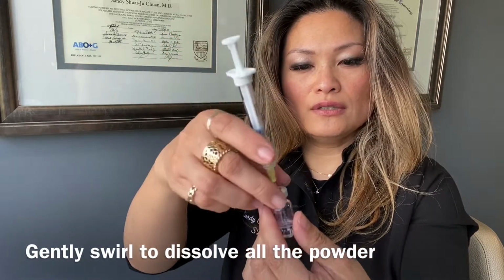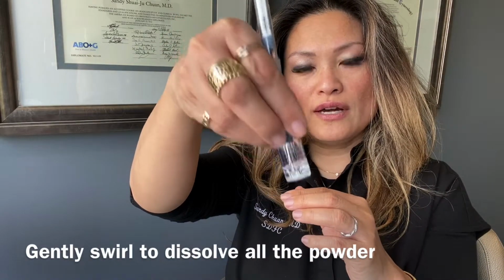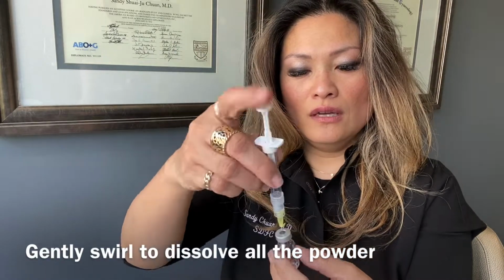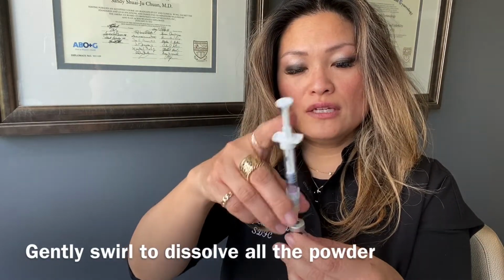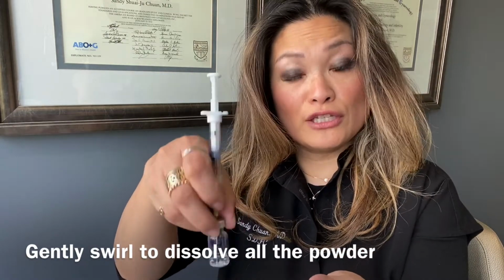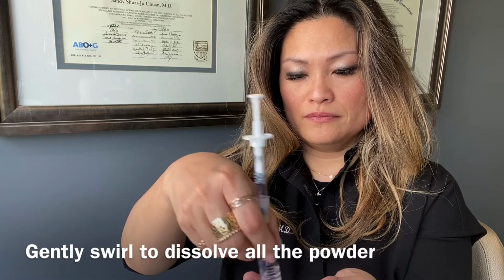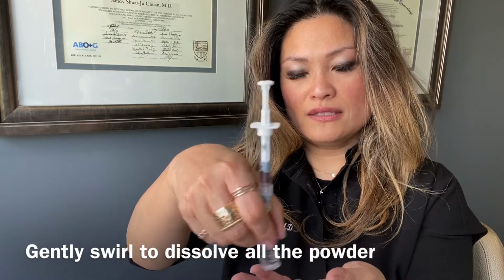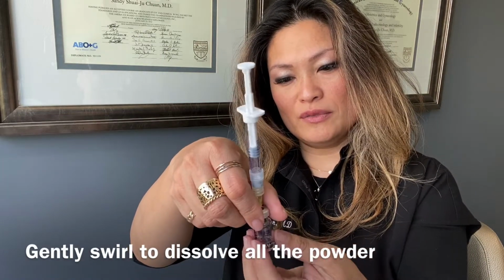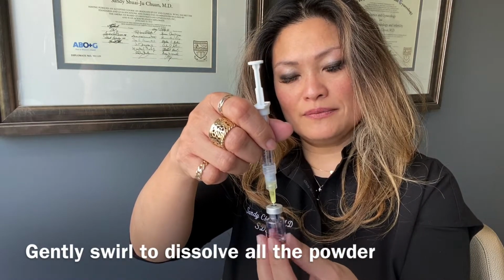And if you need to, like this right now, it's still a little sticky and there's powder on the side, so I just gently swirl it to dissolve it, okay? And so you just want to make sure the whole thing is dissolved before you draw it up to inject, okay? So swirl, swirl, swirl. It may be that this is a demo pack, so it may have been sitting around a little bit longer, so I think it's taking a little bit for the powder to dissolve. But so I'm just gently swirling that.